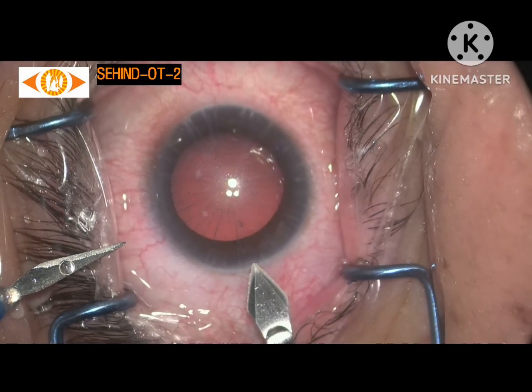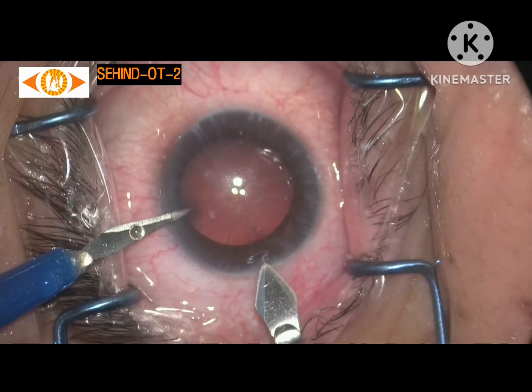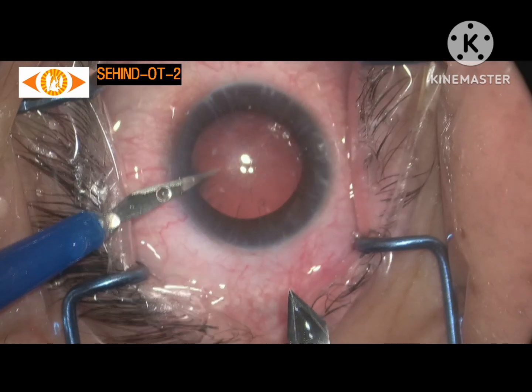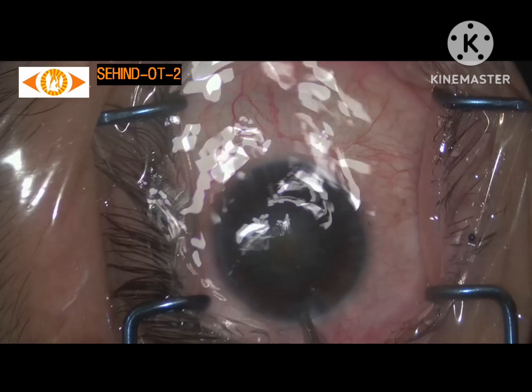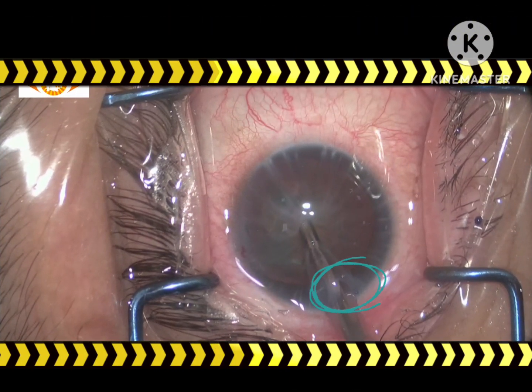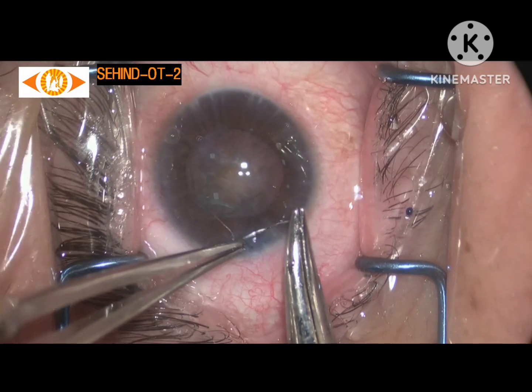We began our case by making the main port and the side port incision. You will see that as soon as we insert our phaco probe, we notice a full thickness corneal split. We then go on to suture the corneal split using 10-0 nylon.